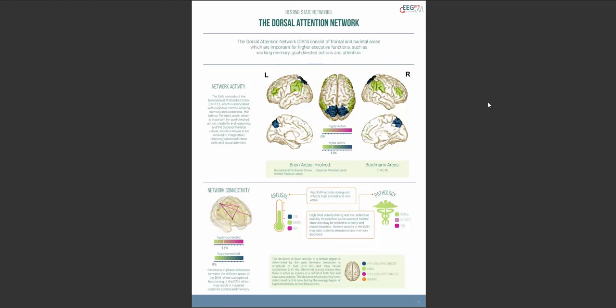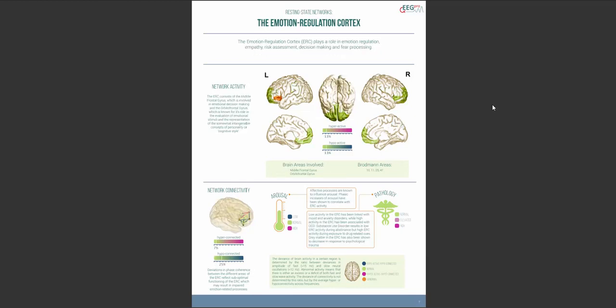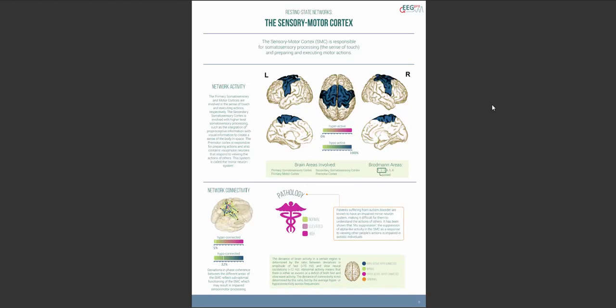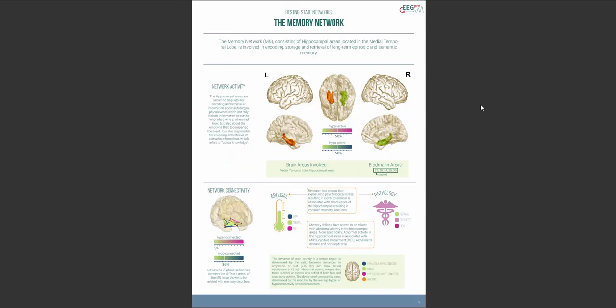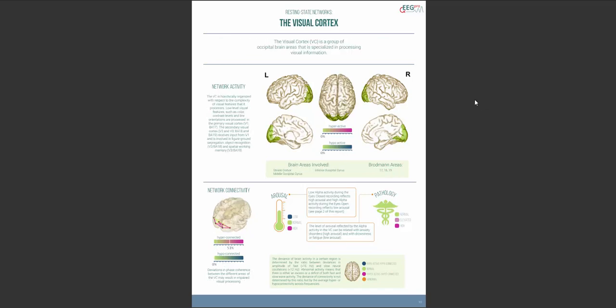The next pages all show the exact same measures for the different resting state networks that have shown to be functionally distinct during resting state EEG recordings. The current page shows the dorsal attention network which is followed by the emotion regulation cortex and then the sensory motor cortex is discussed. The memory network consisting of the left and right hippocampal areas. And finally, the visual cortex is evaluated.